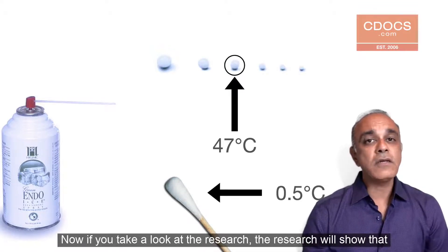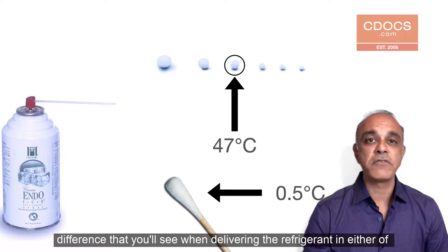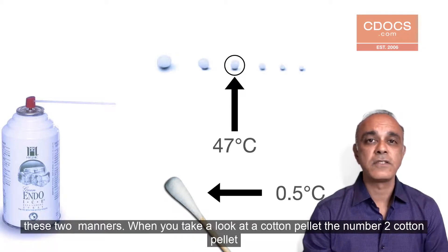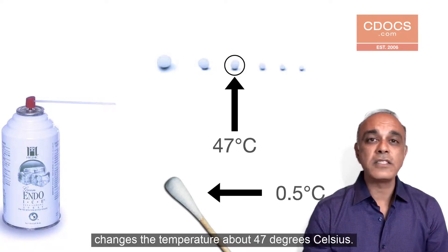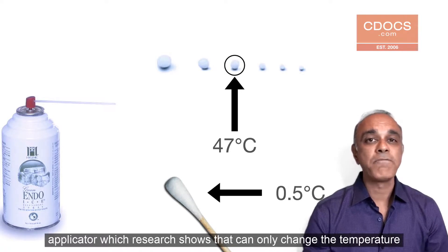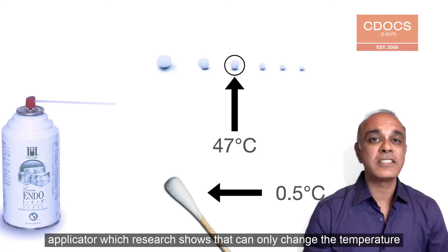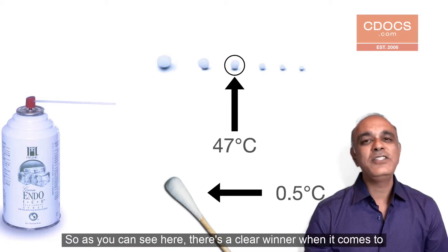If you take a look at the research, it shows that there's actually a big difference in the amount of temperature change when delivering the refrigerant in either of these two manners. A number two cotton pellet changes the temperature about 47 degrees Celsius — that's how much it lowers the temperature — compared to a cotton tip applicator, which research shows can only change the temperature about 0.5 degrees Celsius.